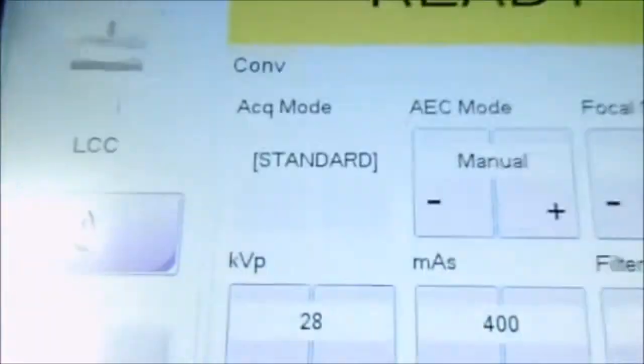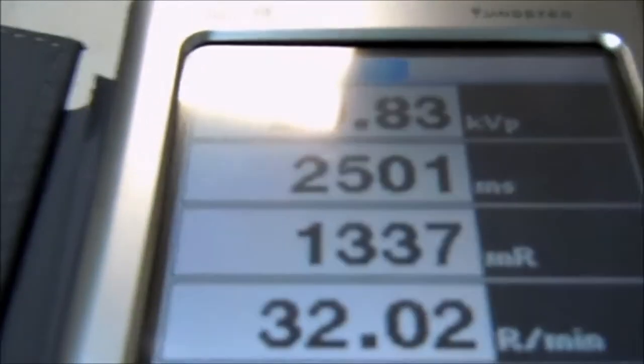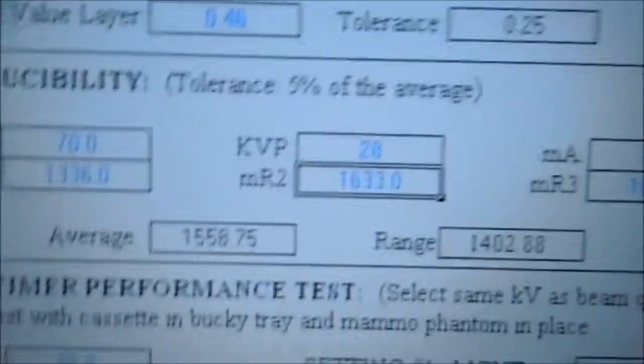We're going to take our second shot at the same techniques and just make sure that we're getting the same readings throughout each shot. Here we have 13.37, so we're going to put here 13.37.